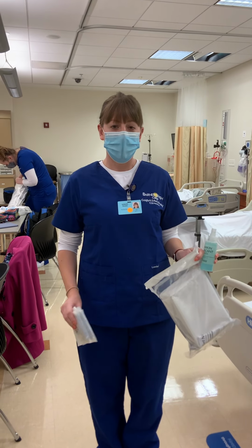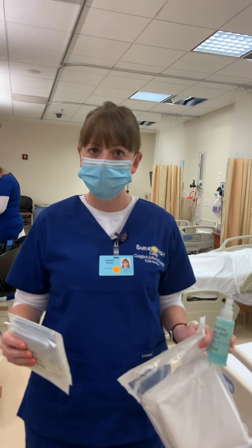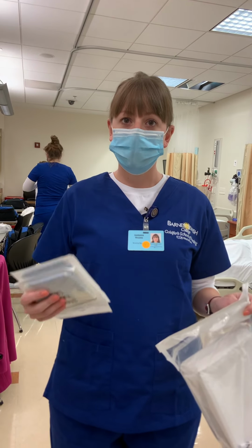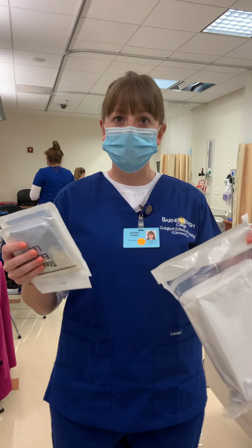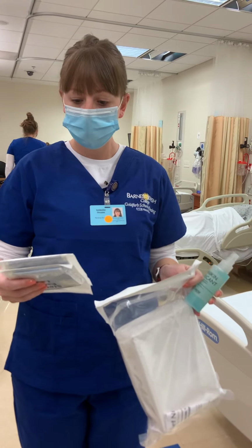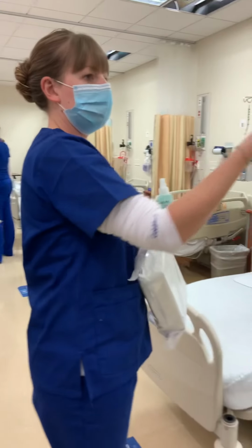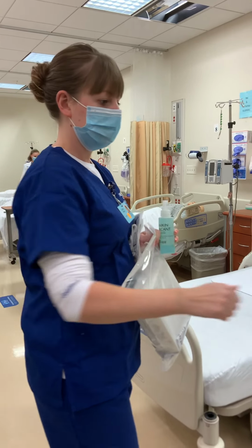Good. All right, so today I am showing how to insert a Foley catheter into a patient. So I have reviewed my orders that were put in to insert the Foley for my patient. I've gathered my supplies. I have checked the expiration dates on everything, and everything is good to use. So now I am going to perform hand hygiene outside the patient's room and enter the patient's room.